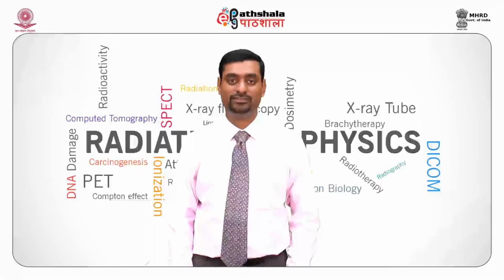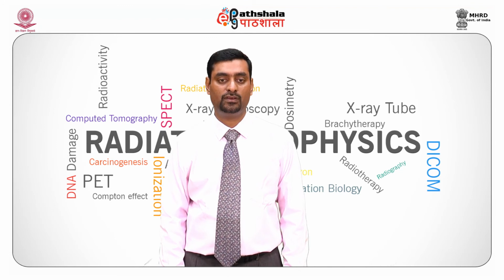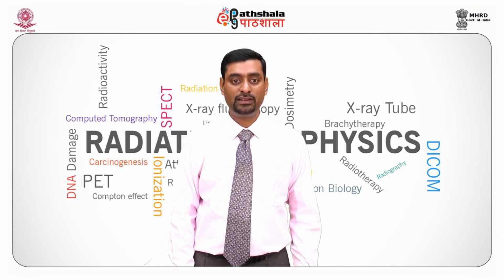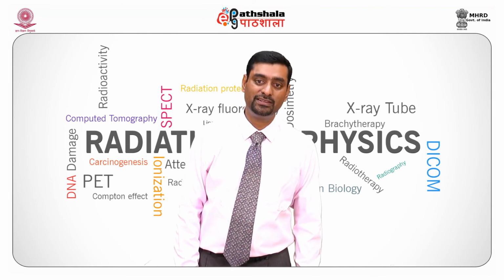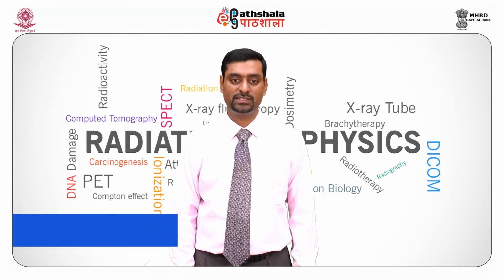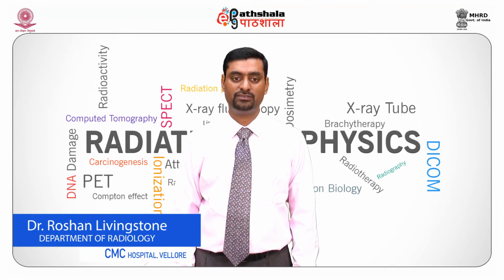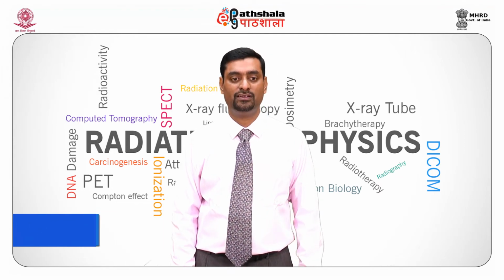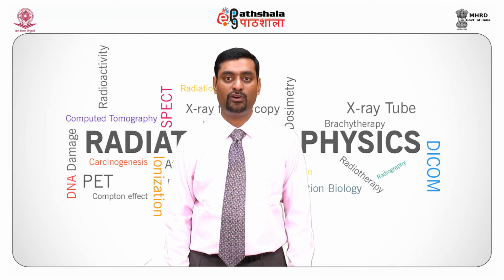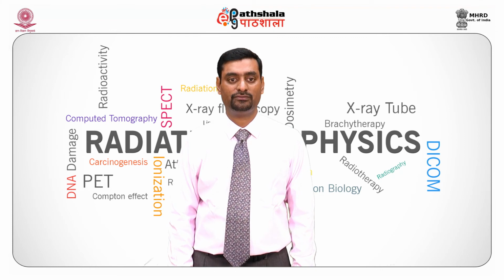Can be the final stage, so that we are going to fix what is present in the film. Fixing stops any further film development, clears the image by removing the remaining silver halide, fixes the image so that no further changes take place, completes the process of hardening of the film emulsion, and now fixer is acidic, hence the pH is from 4 to 4.5.